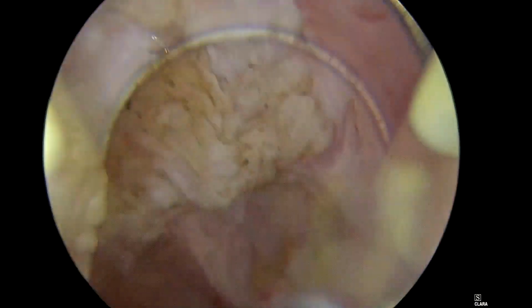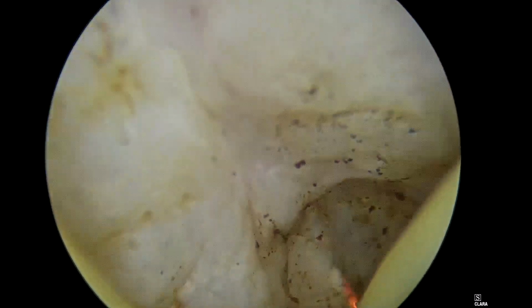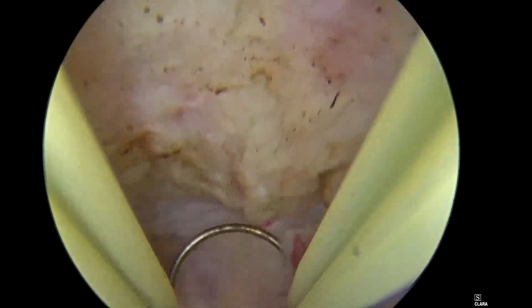I'm going to play this small part in slow motion, so you can see how the bubbles are swept, travel, and go to the base of the myoma. The danger of air embolism is catastrophically more when the myoma is on the anterior wall, because the raw surface is anterior and the bubbles travel and float anteriorly.